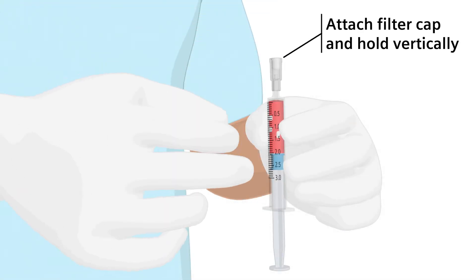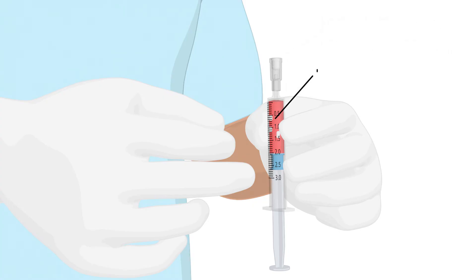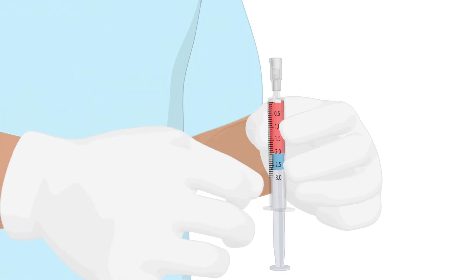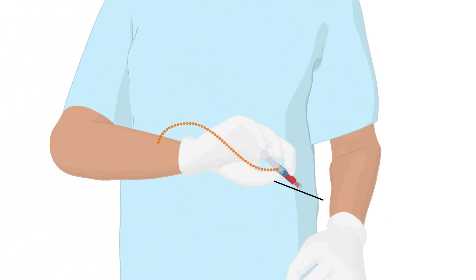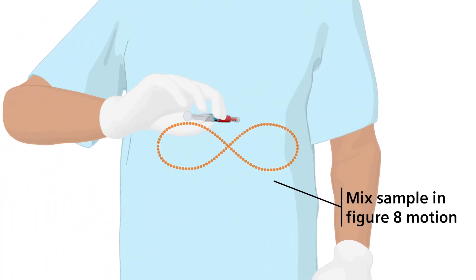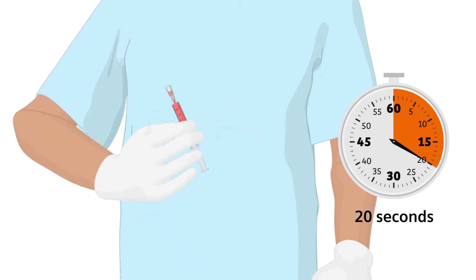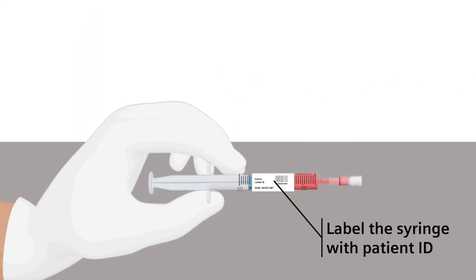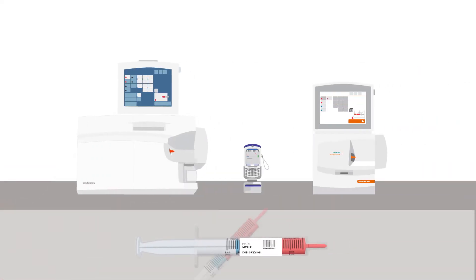Attach the filter cap on the luer tip of the syringe and hold the syringe vertically, then gently tap the syringe so that air bubbles are forced to the top. Expel any air bubbles into the filter cap. Mix the sample thoroughly by rotating your wrist back and forth for a minimum of 20 seconds. This helps to dissolve the heparin and minimize clot formation in the syringe. Label the syringe with the patient ID and immediately transport the sample to a Siemens Healthineers blood gas system.